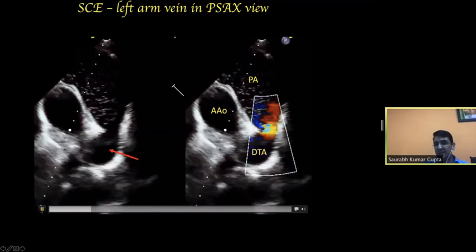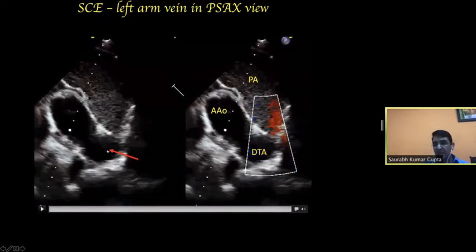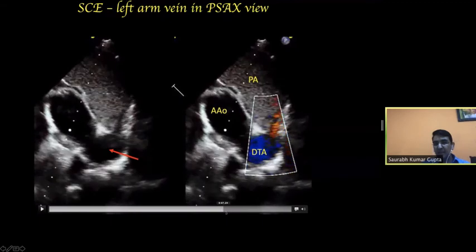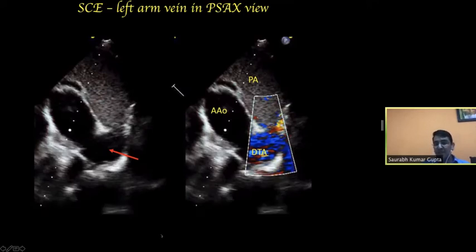to look at the saline contrast. Now look at this. Focus on this arrow. For the benefit of everybody, I'll just scroll it slowly. You can see some bubbles getting into the aorta from the PA, and this is a case of hypertensive PDA causing severe PAH. If you don't do this, you are likely to tell the patient that it is idiopathic PAH, and we know that management and the outcomes of these patients are quite different.